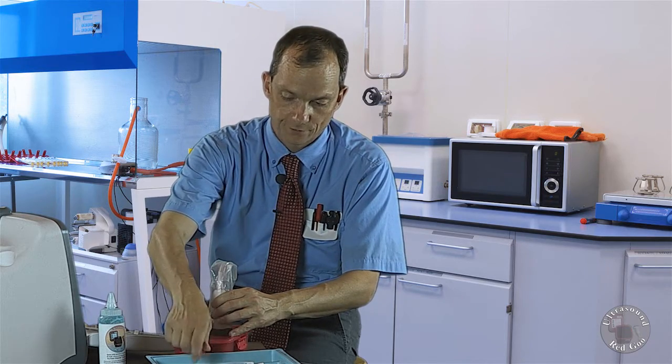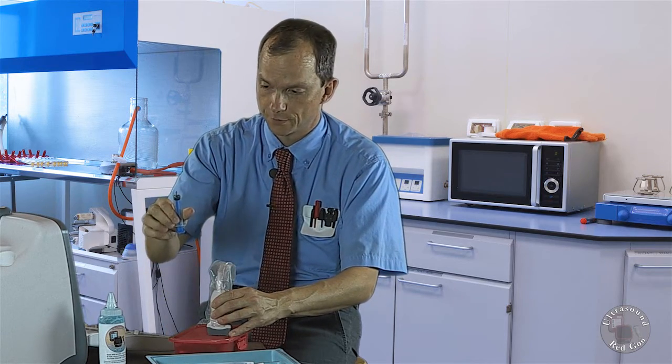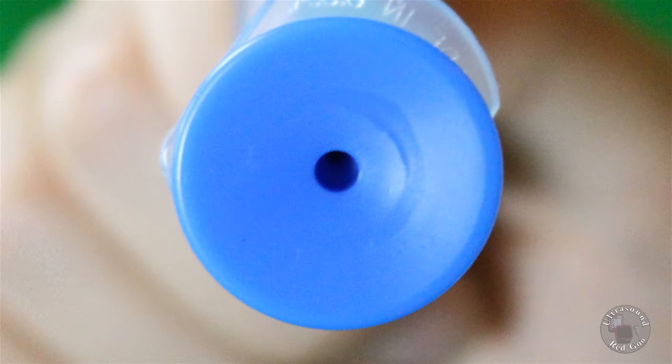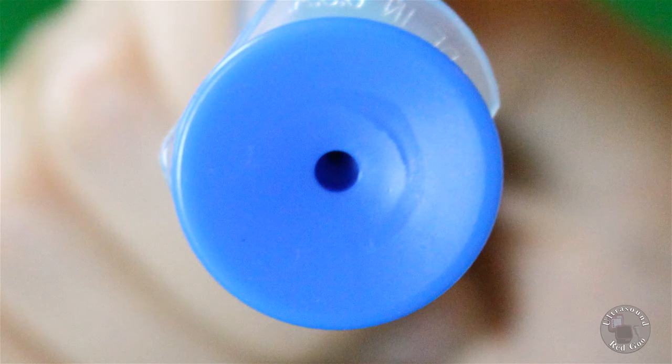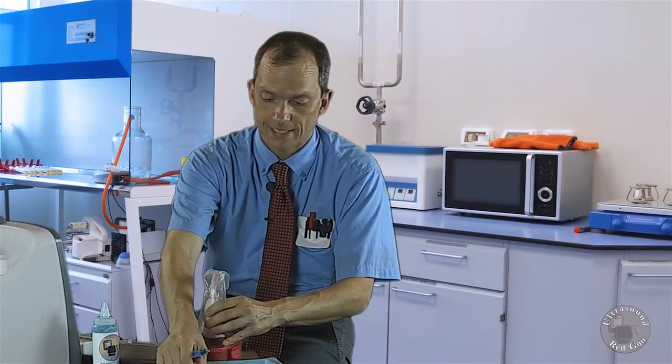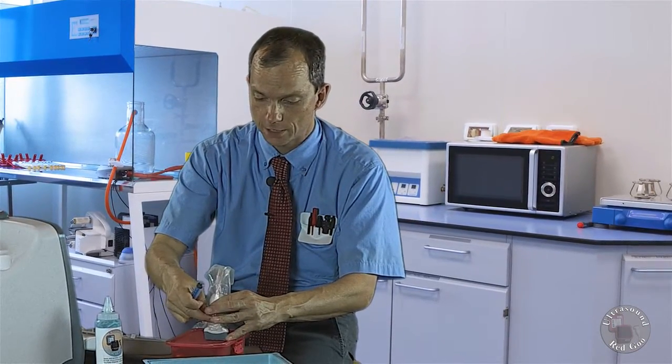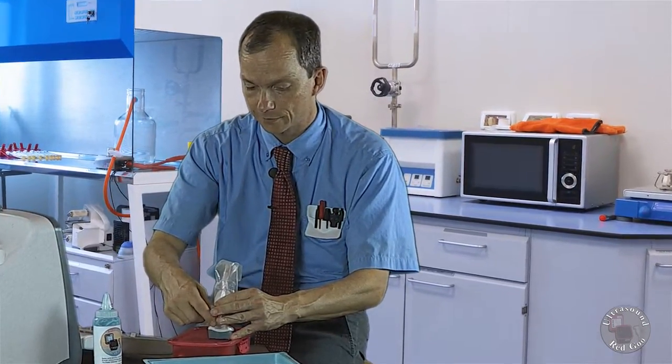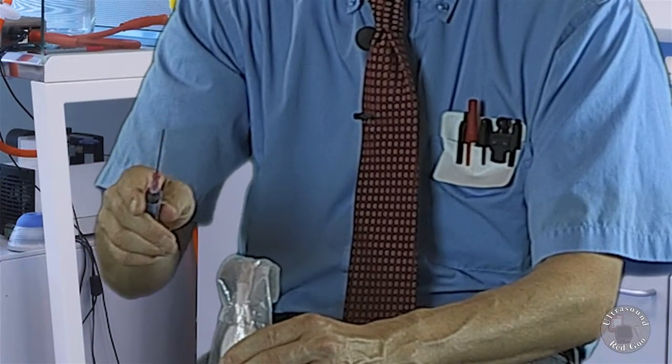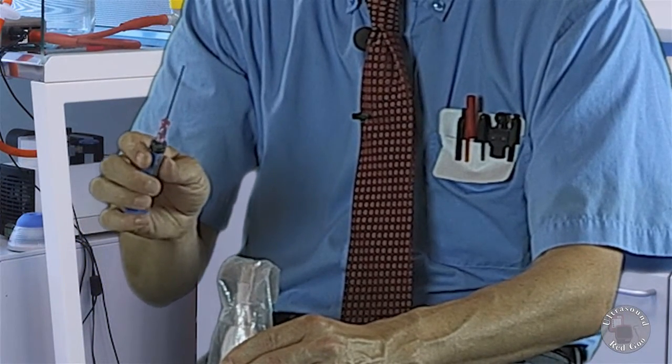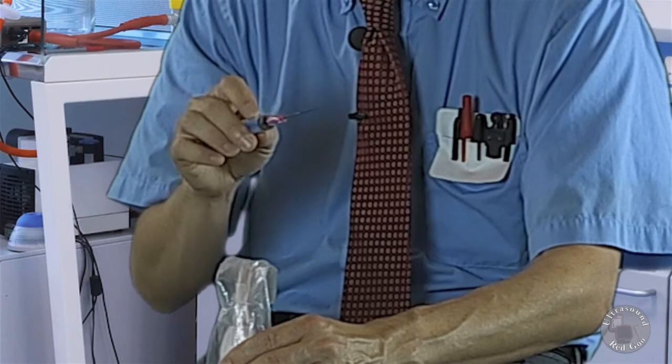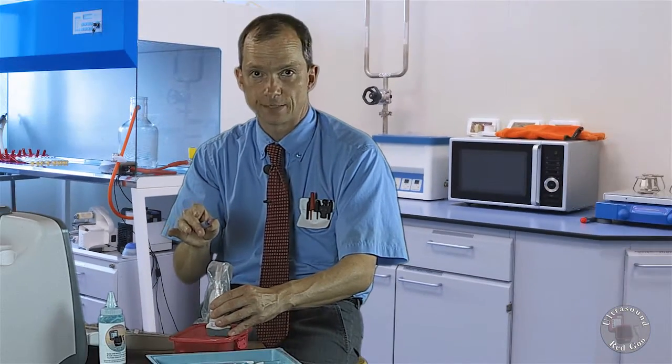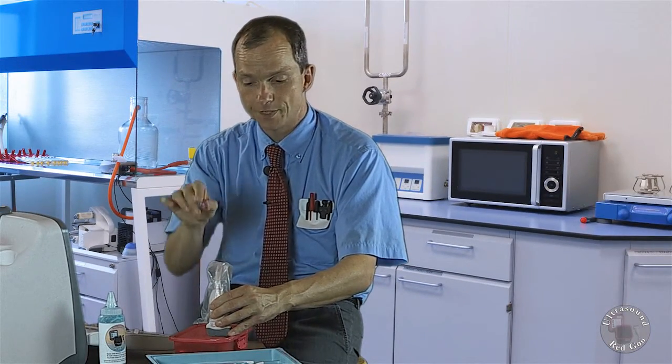I'm going to go ahead and put it down and find my simulated vessel. Now when I do that, I'm going to take my personal preference which is this syringe here - the plunger has a channel for the guide wire or Seldinger wire to go through. I'm also going to use, for the sake of training, the rigid catheter. It looks like a straight hypodermic needle.